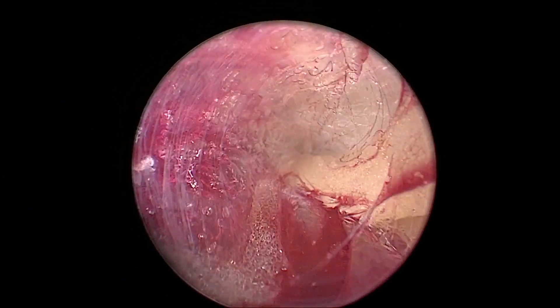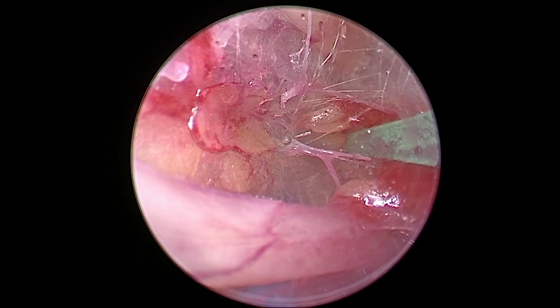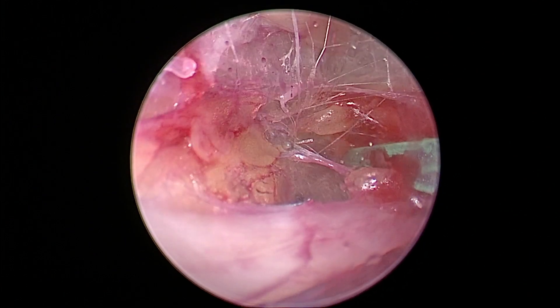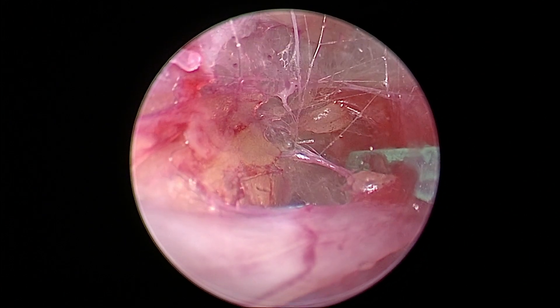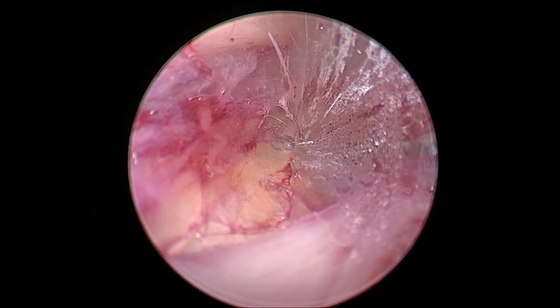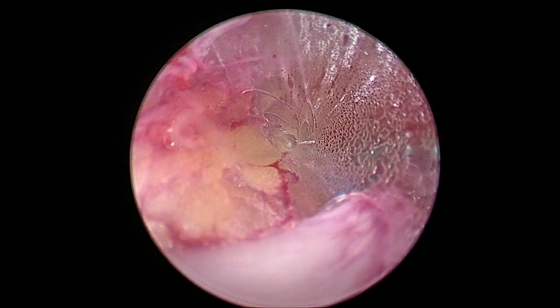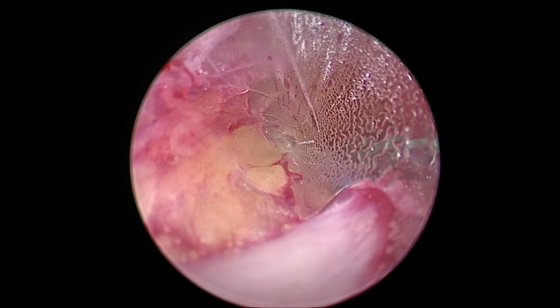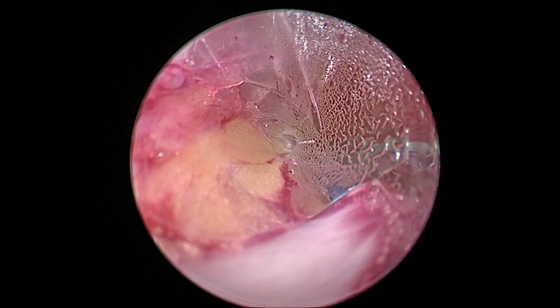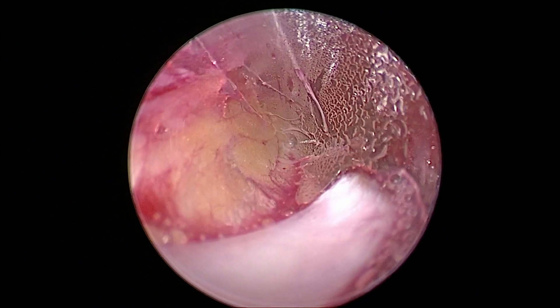Occasionally I just have to push a little bit of adventitia off and then keep going. Here's a very large branch that's moving away from me, which is usually difficult to take. I just cauterize until I don't see any more spray, move forward just a little bit, cauterize again, don't see any spray, and when I feel comfortable I just pull back and it cuts the branch.